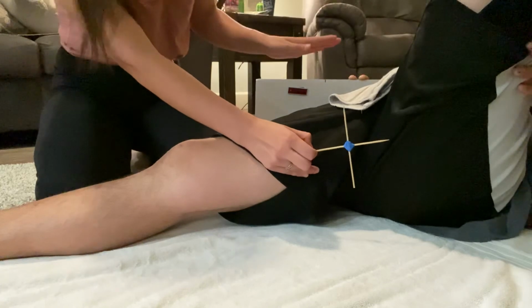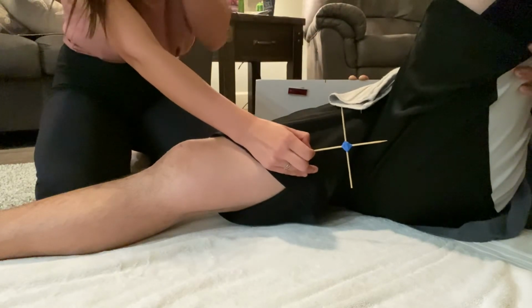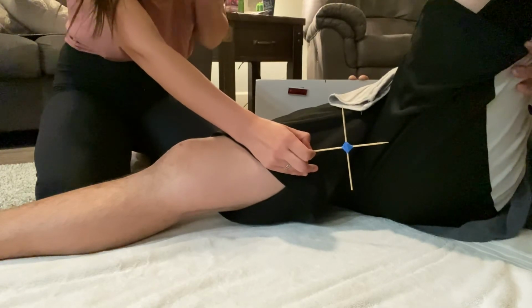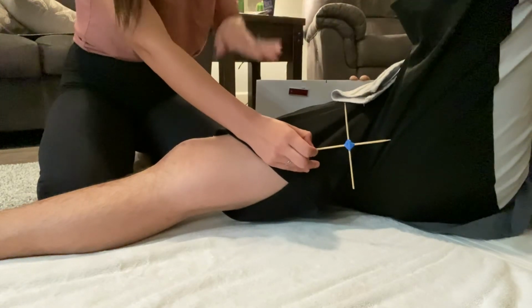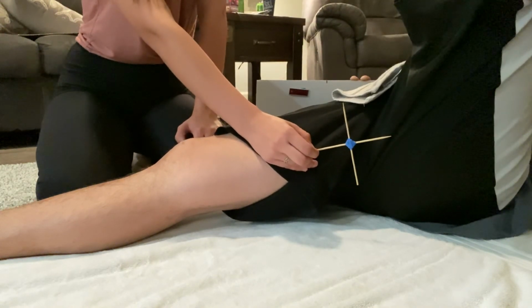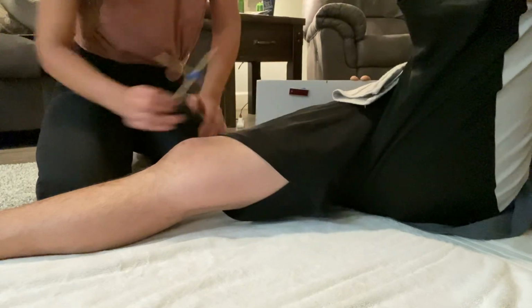Our collimation, we would use the whole 10 by 12 of the cassette. And our book says that if we are using a grid, it should be vertical, but the lead strips in the grid should be horizontal. So we've got our marker, we are shielded, our CR is in place, and we're gonna suspend respirations. Please hold your breath. Boop. Okay, and that is our cross table lateral hip. You can relax.